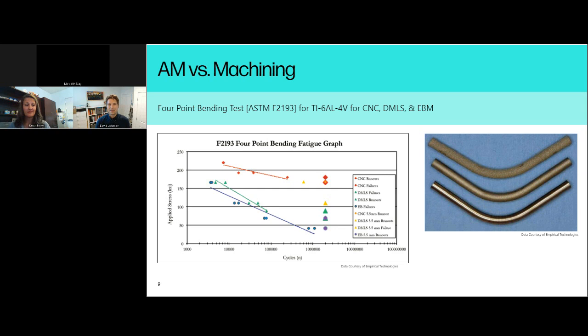Gotcha. And then one interesting thing I noticed, because I'm less familiar with the technologies that you chose, but with the layer lines moving up as the rod goes, was that worst case scenario planning, or obviously if it's isotropic or not, potentially different, but is that just making worst case scenario and why it was specifically designed that way? I think at the time, I mean, again, this was back in 2016, that was sort of the simplest and least amount of impact on how to print a rod, and also did, like you said, represent sort of worst case for the geometry. Yes.